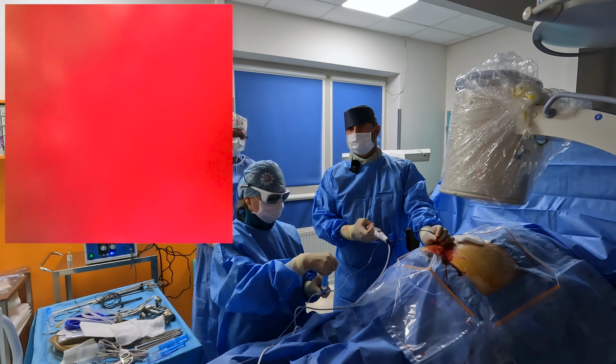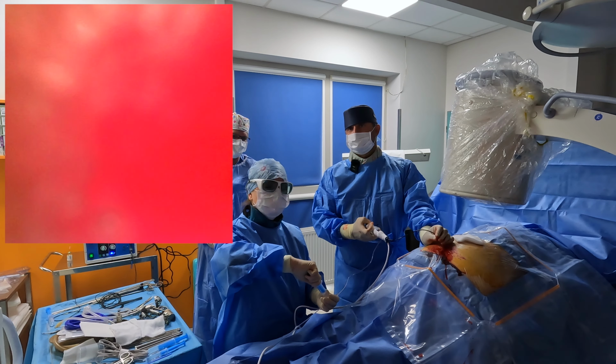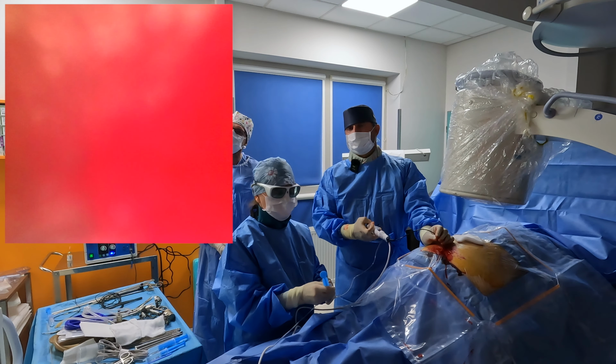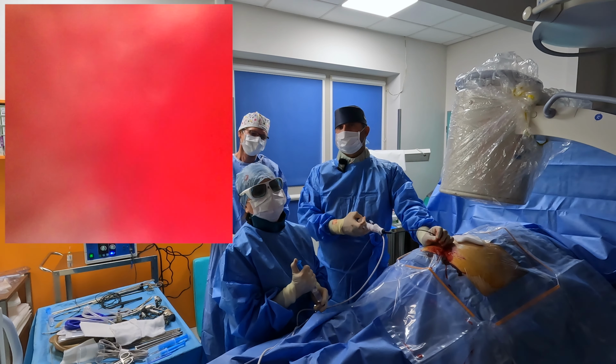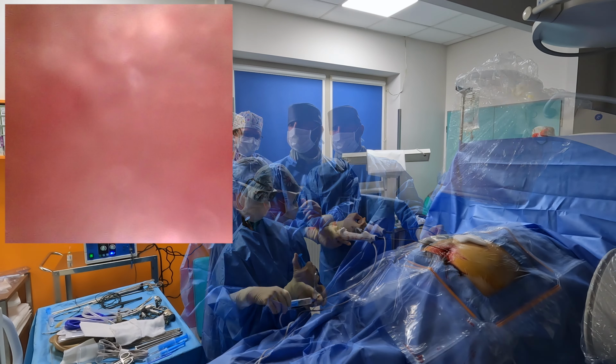So we have checked the posterior epidural space without any significant findings. If we found something, we could give a cortisol injection, for example. If we found some adhesions, we could take care of adhesions with a radio frequency probe.